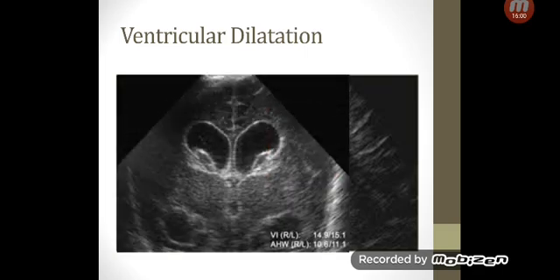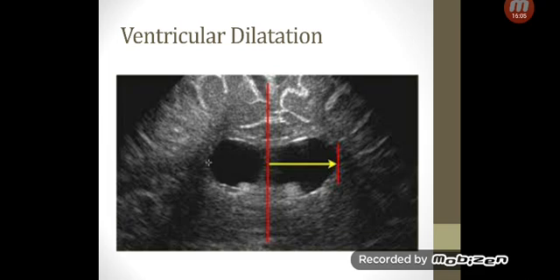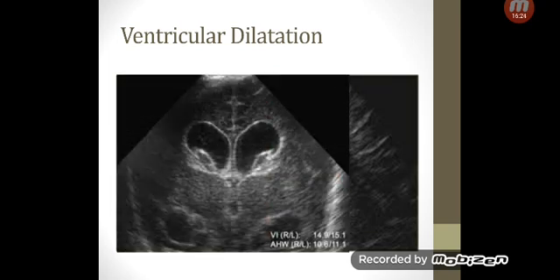And which view are we measuring at? You remember that on coronal views, C3, I like to say, or C4, I think. C4, where the third ventricle is shown. So when the third ventricle is in the picture, you draw your midline, you get the measurement for the lateral ventricle. Some ventricles, as we said, don't really need measurements to appreciate that they're dilated. But again, it's good to get a measurement for your follow-ups if you want to.